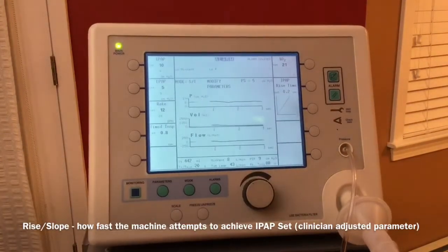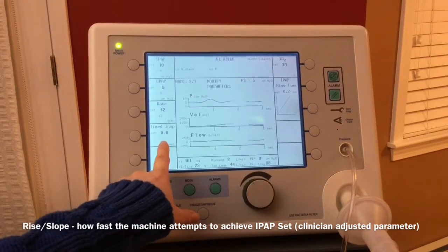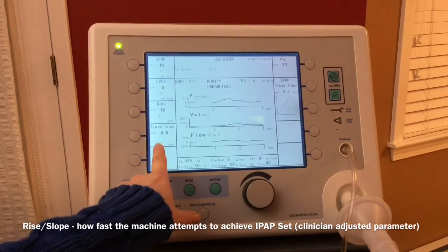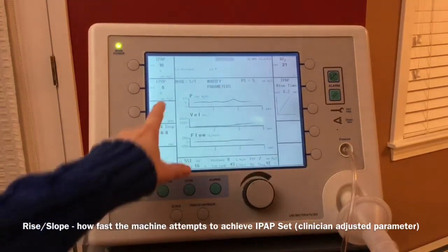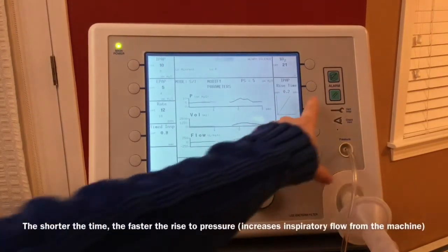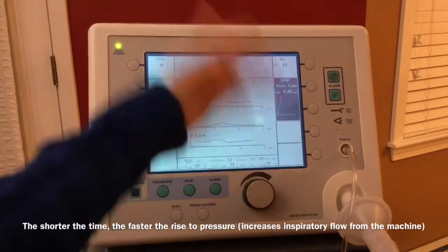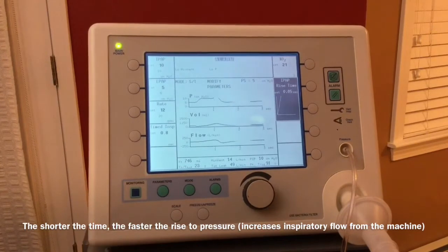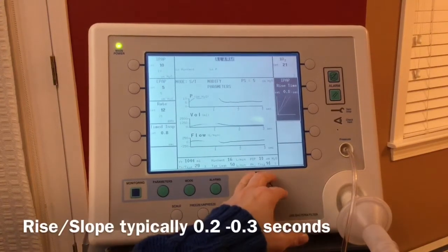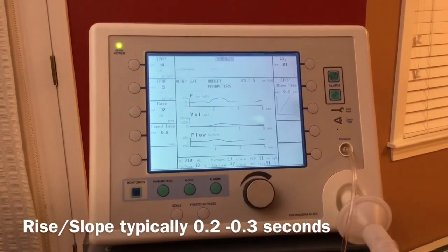Rise to pressure, or rise to IPAP, is 0.2 seconds of the 0.8 seconds, so it's about 1/4 of the inspiratory time. So in the first 1/4, it should rise to the inspiratory set pressure, which is 10 for this machine, and that's how that works. The shorter the time, the faster the rise to pressure, so the quicker it will meet the pressure. A comfortable rise to pressure is about 0.2 to 0.3, okay?